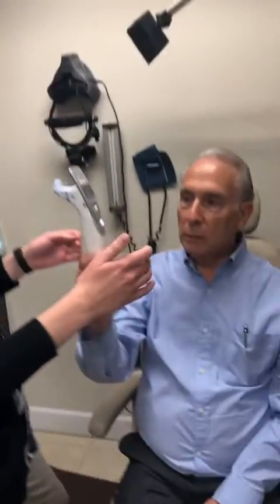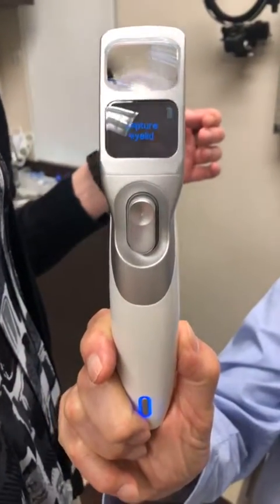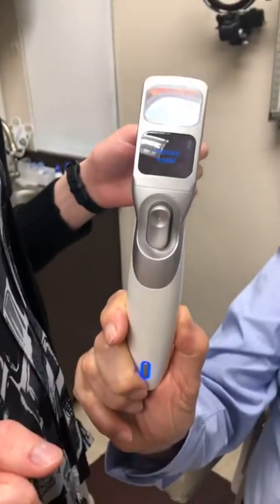We're using the ILUX to express my meibomian glands. We're going to start with the lower lid first. You want to anesthetize your patient with proparacaine or tetracaine. This is the ILUX unit right here, and the company is owned by Alcon. It's a new Alcon product.